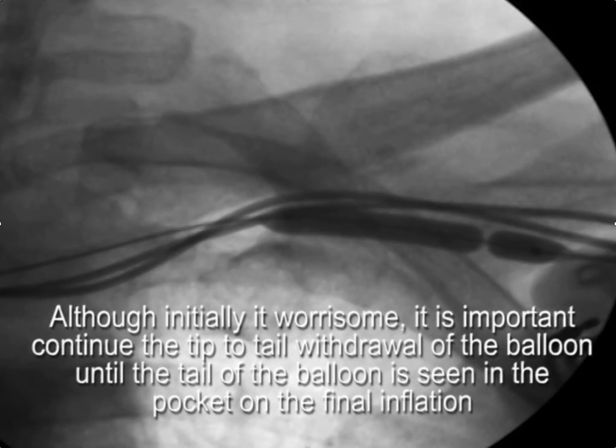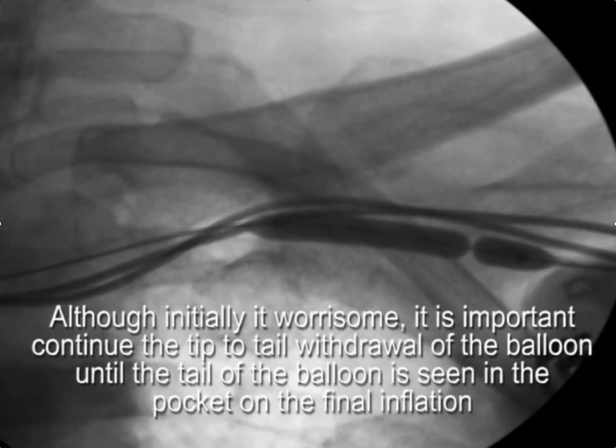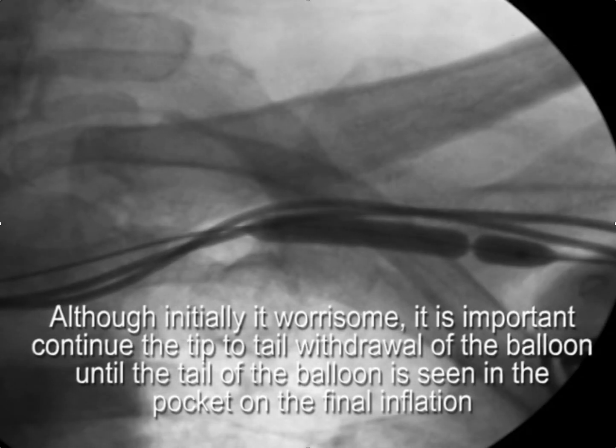You can see here that the initial impression was that we didn't need to bring the balloon back. But here you see this very tight stenosis that would have been very difficult to deal with if we hadn't brought the balloon further back and inflated.